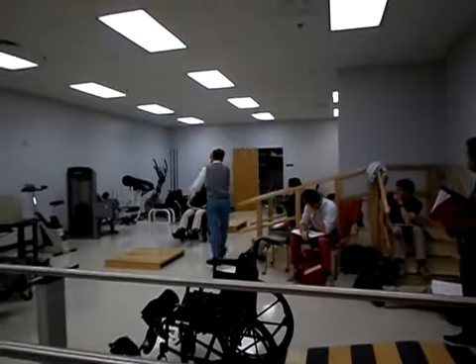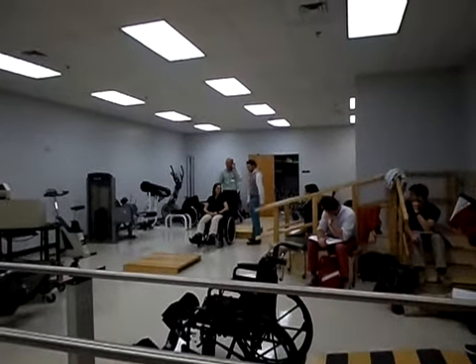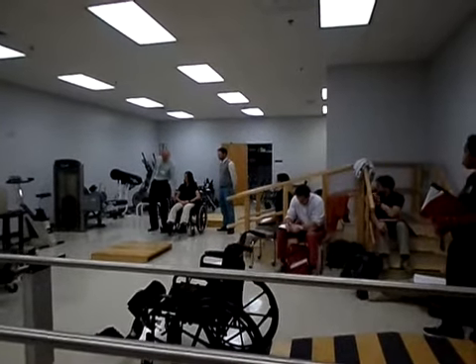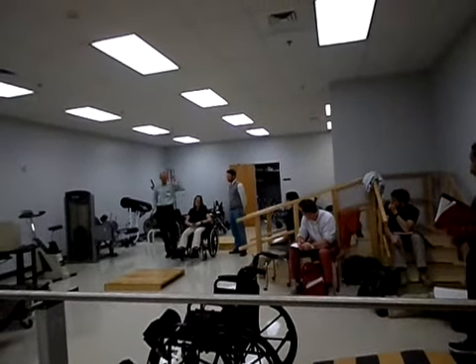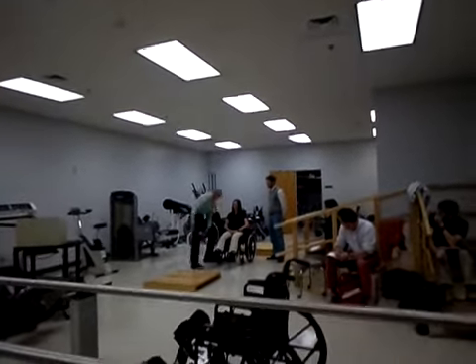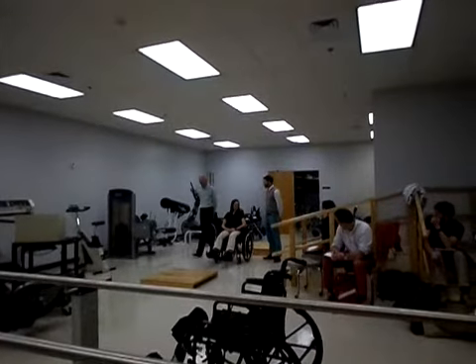Okay, Jay's going to help me to get up. Where should Jay grab the wheelchair? Basic principle is something that's not going to move. Should he grab the armrest? No. Because that could just come off, right? Should he grab a leg rest? No. That can move. All right. Should he stick his hand on the wheel? That's going to move. So where can he grab?